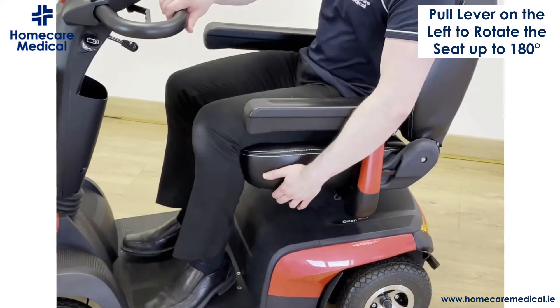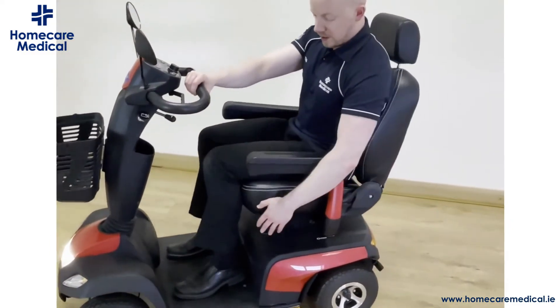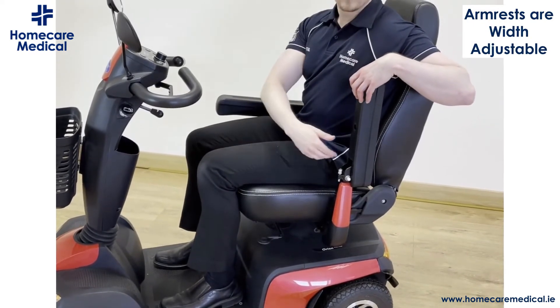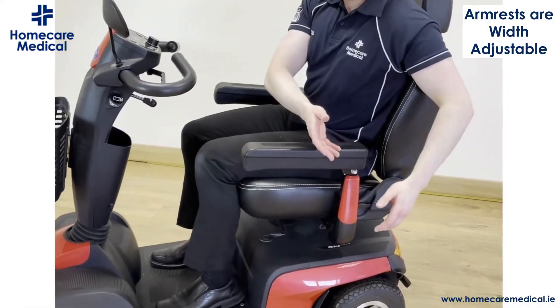The seat on the Orion is highly adjustable. This lever — if you pull it up — allows you to swivel the seat out to make it easier to get in and out of. The armrests can be lifted up out of the way and they're also width adjustable, with a turning knob that will allow you to make them a little bit wider.